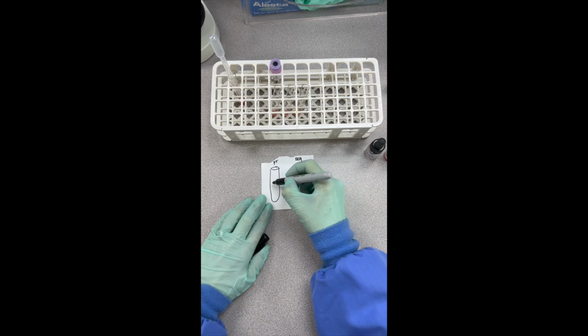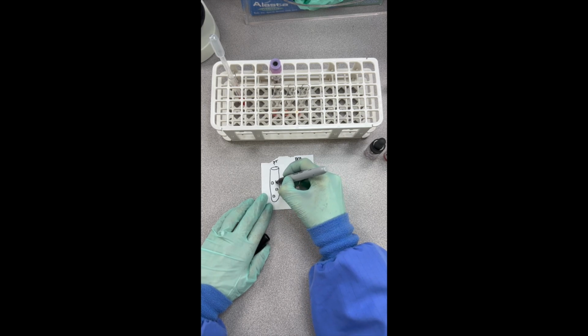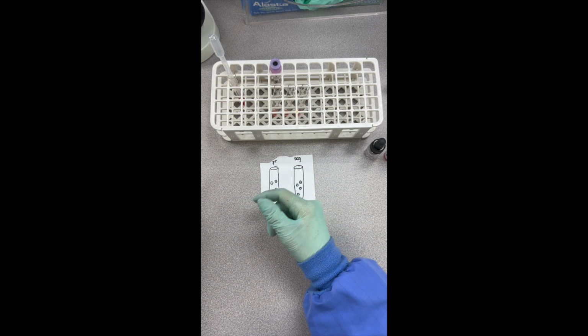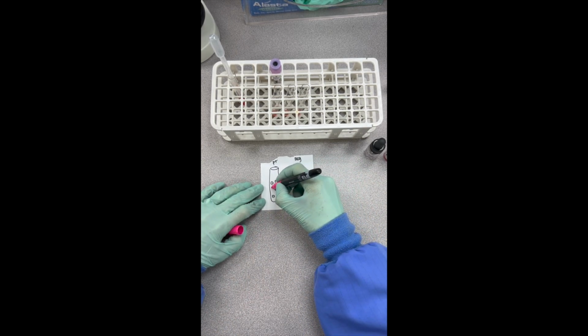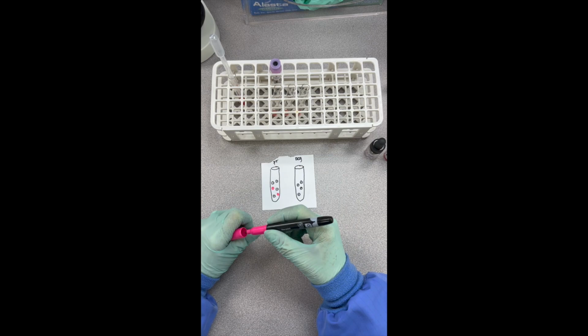Okay. Now we're doing this on a mom who is Rh negative. All right. Remember that. And she had a baby that was Rh positive. Okay, here's my Rh positive cells. Oops, put the plus there.